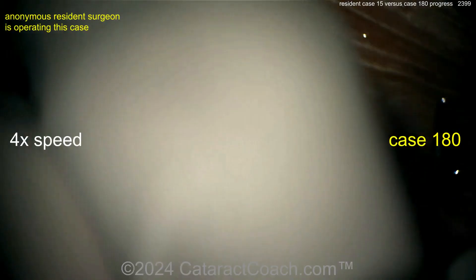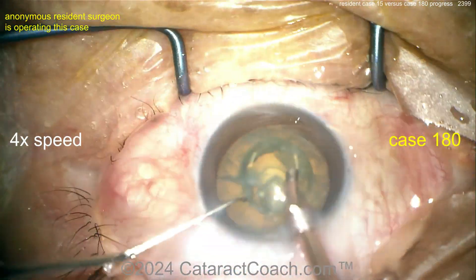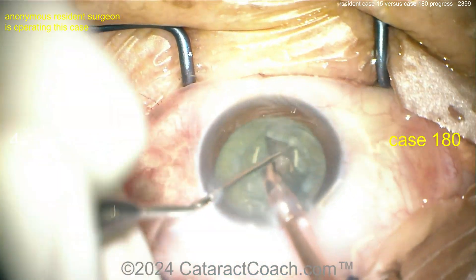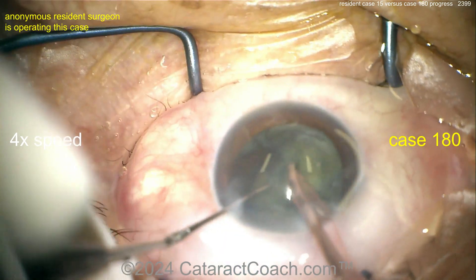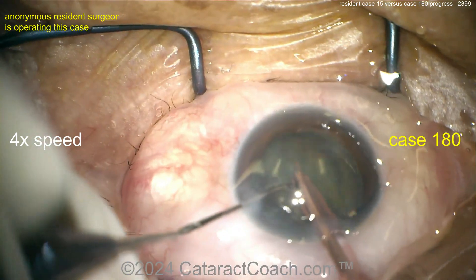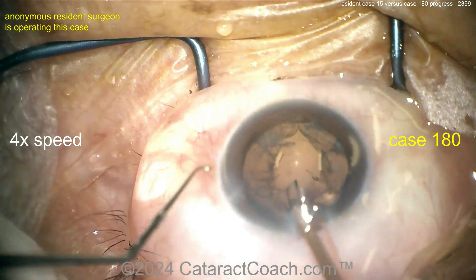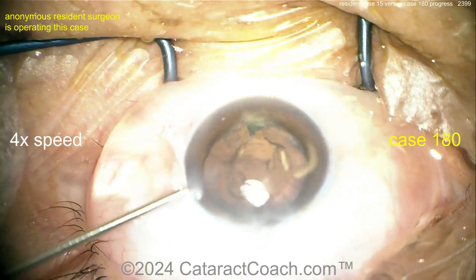Readjusting — okay, I can appreciate that. Now let's see what's improved since case 15. Groove down the middle, cracking it — there you go. More efficient, cracking it again, two halves, now rotating it. But look — the eye is not in primary for case 180. Look where the three dots of the microscope light are — they're at the superior limbus because the eye is not in primary. Raise the patient's chin. You want the iris to be parallel to the floor of the operating room. In this case, the patient's chin is tucked.